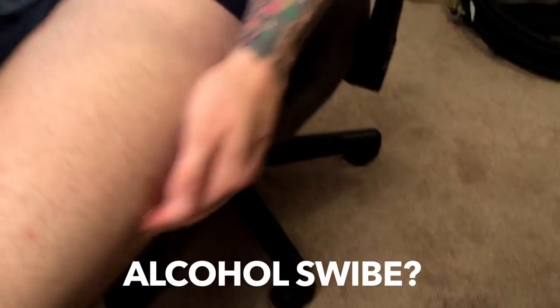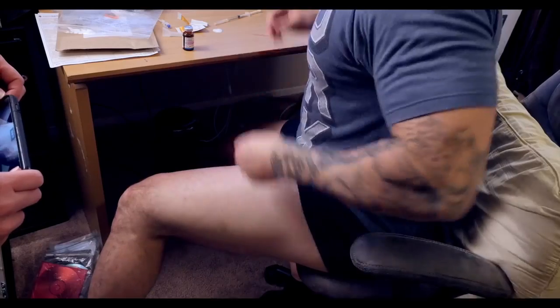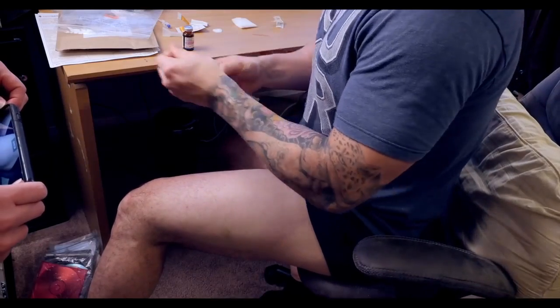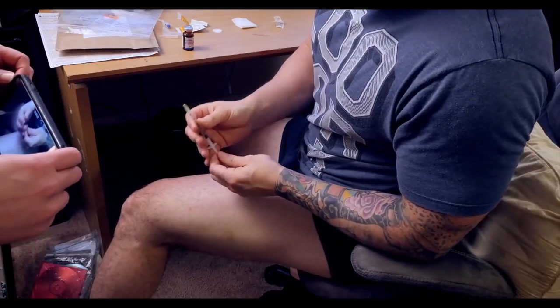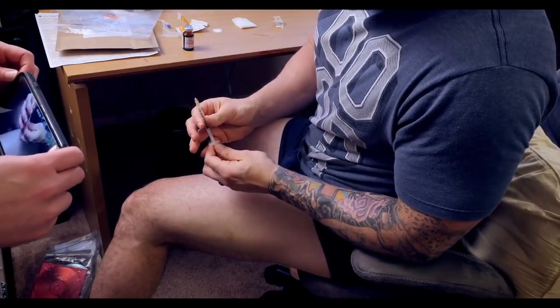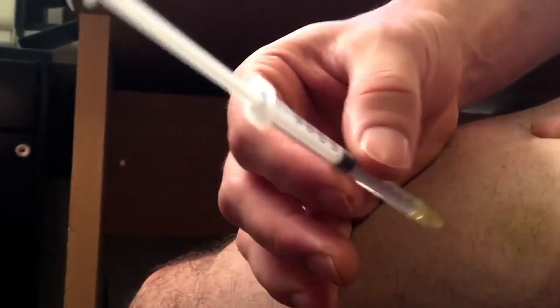All that's left to do is the actual injecting part. I take an alcohol swipe and wipe the outer quadrant. Then I have this little cotton cloth ready. The injection itself used to scare me, which is fair, but it got a lot easier the more I did it. The only real thing you have to worry about is keeping your leg totally relaxed when you push it in.